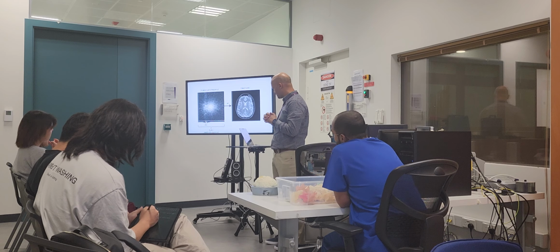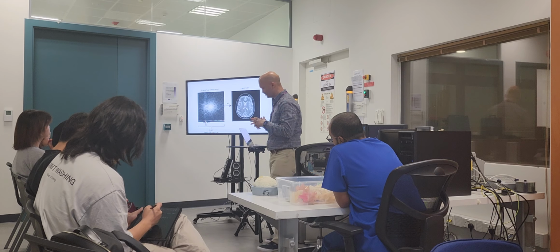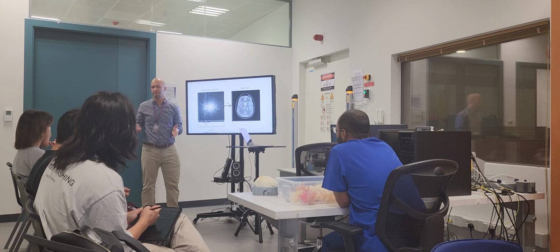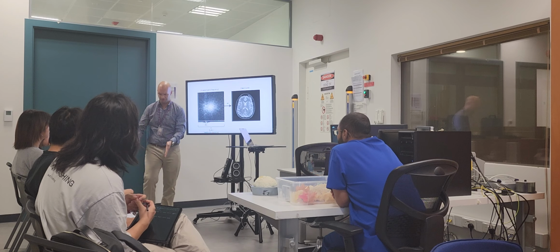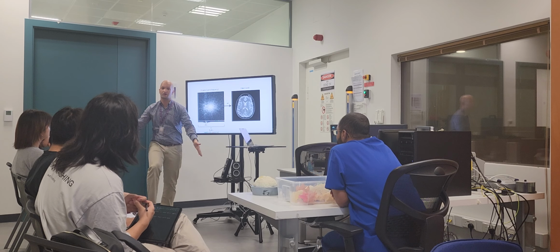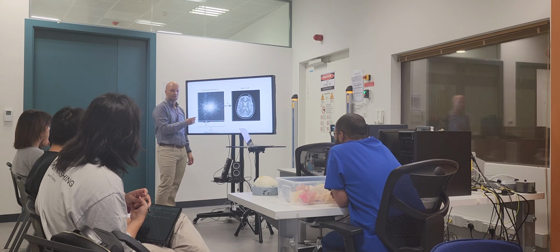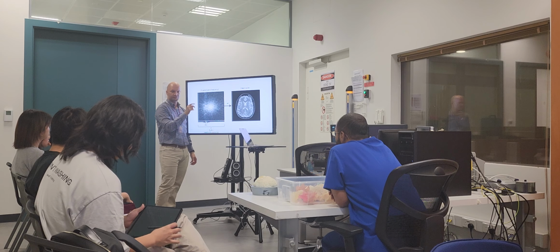And to give you a quick intuition about this, what do we care about in the image? Spatial resolution and field of view. That's the first thing. How big is my field of view for the head or for the knee, right? So how do I play with the field of view in an MRI scanner? I play with the spacing of the sampling. So that's what we call reciprocality.